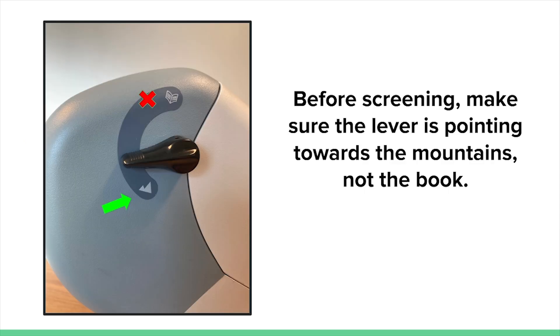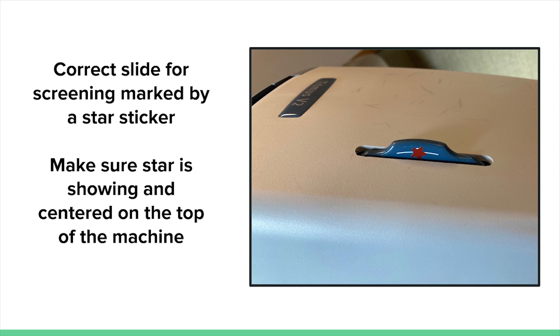The visual acuity machine can test for both near and distance visual acuity. However, Friends for Sight volunteers will only be screening for distance visual acuity. To make sure the machine is testing the correct acuity, make sure the lever near the viewing end is pointing towards the mountain image, and not the book image. The machine contains different test slides. Friends for Sight volunteers will only be using a specific slide to screen. This slide number is different on each machine. The right slide is marked with a star sticker on the dial.